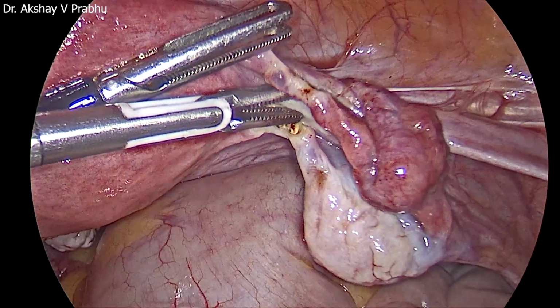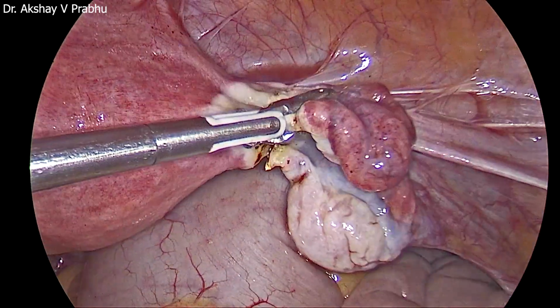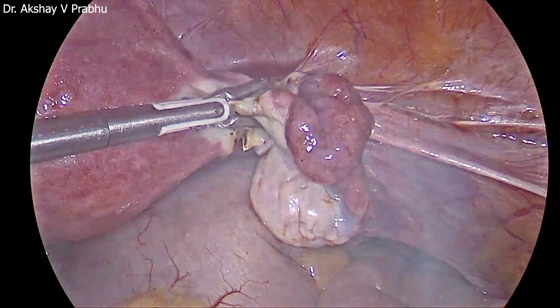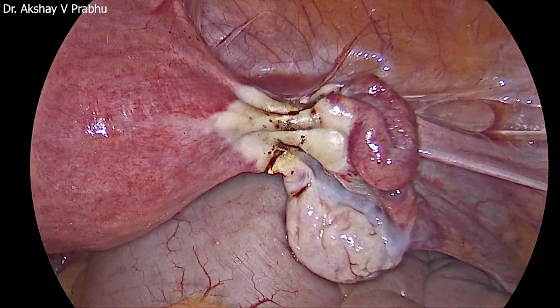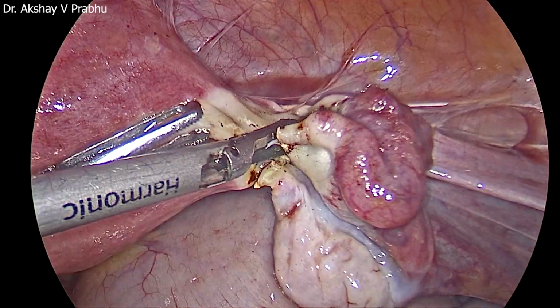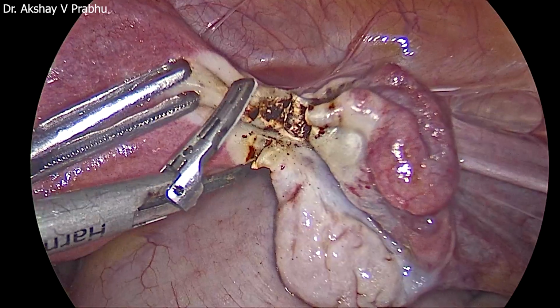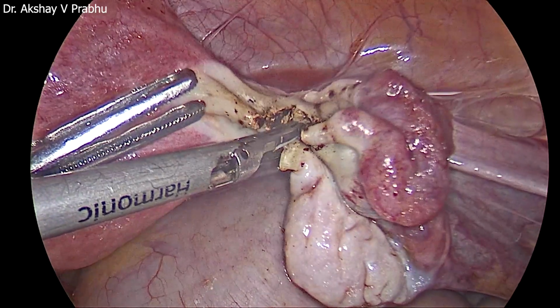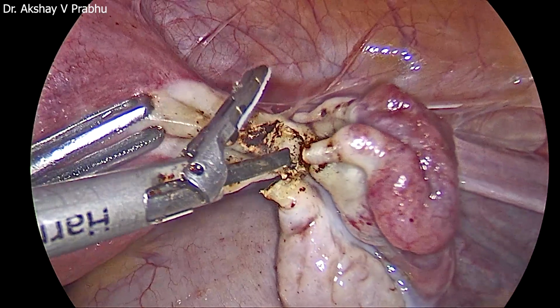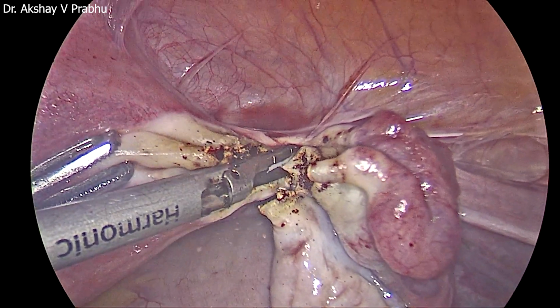So stepwise devascularization is what I try first, following the principle of normal to abnormal. So these all structures are normal. Adnexa is not affected. The cornual structures are not affected. So I'm taking whatever is normal first, tackling them, and then leaving what is abnormal to tackle later. Because if you try tackling the abnormal areas first, there will be unnecessary bleeding, the field will be dirty, and then even taking normal areas will be a big headache.